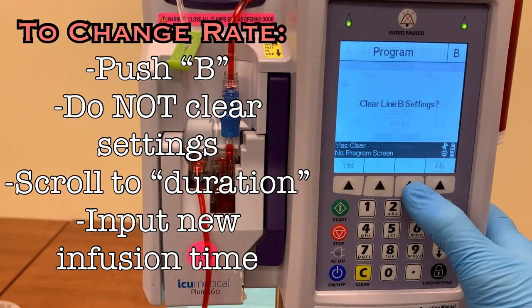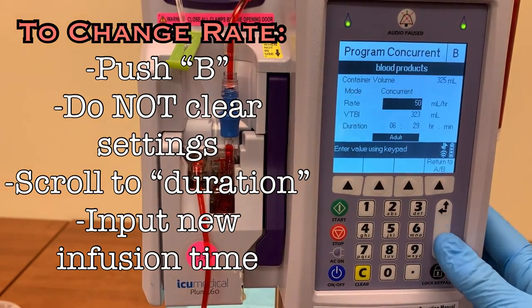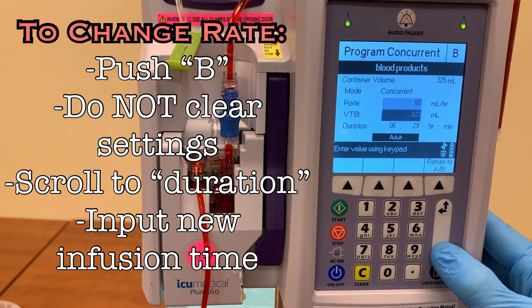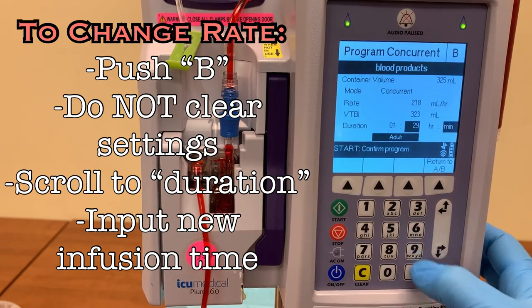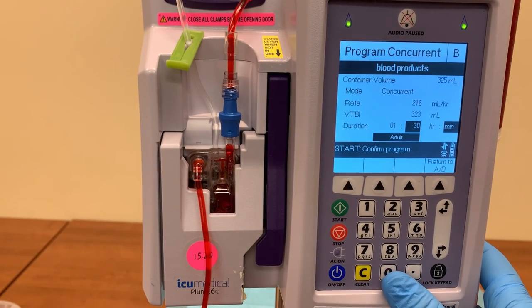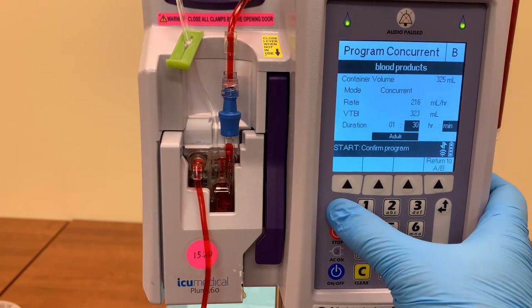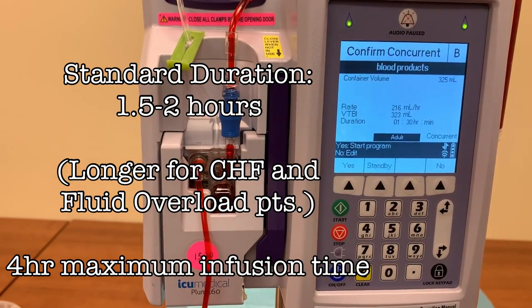When changing the rate, enter the desired time of infusion into the duration field. Policy does not specify a specific rate of infusion, only specific time frames. Some units will have more or less than 325 milliliters of blood, and they still need to be delivered within a specific time frame, so entering a duration of 1.5 or 2 hours will allow the pump to calculate that specific rate for this unit of blood.